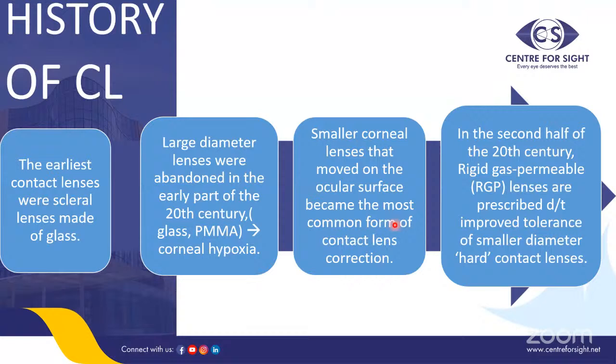However, as we progressed through the 20th century, there was the introduction of rigid gas permeable lenses, and there was improved tolerance as the quality of these contact lenses improved and the difficulty of corneal hypoxia was tackled.